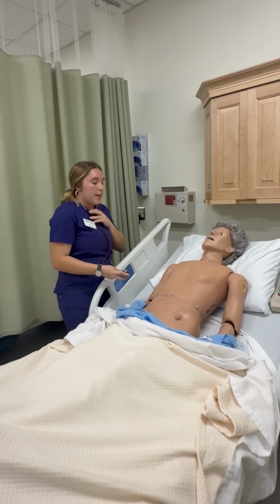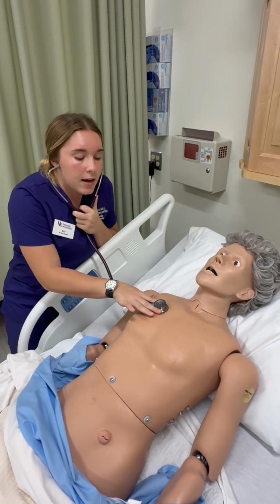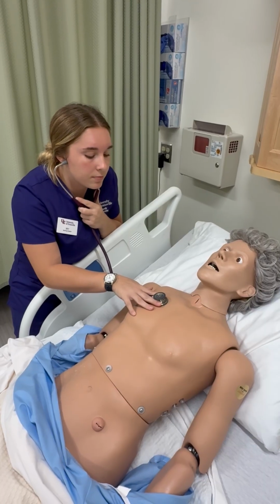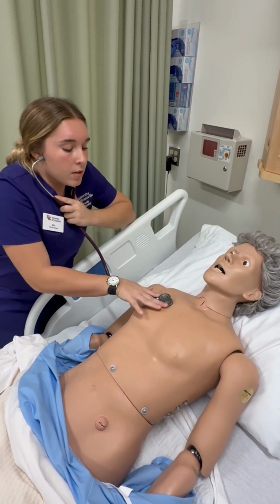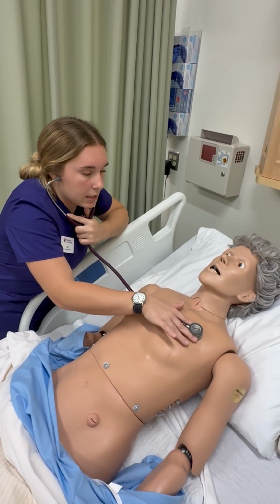So I would start at the mid-clavicular line around the second intercostal space. And at each spot that I put my stethoscope, I'm going to listen for a full breath in and out. So I'm going to move over now to the left upper lobe, still at the mid-clavicular line around the second intercostal space.